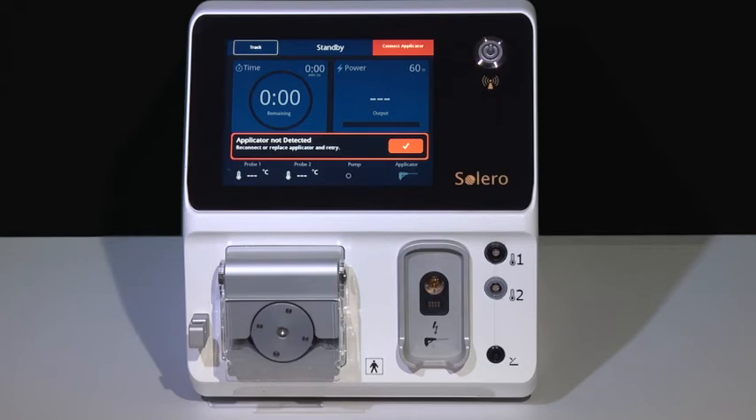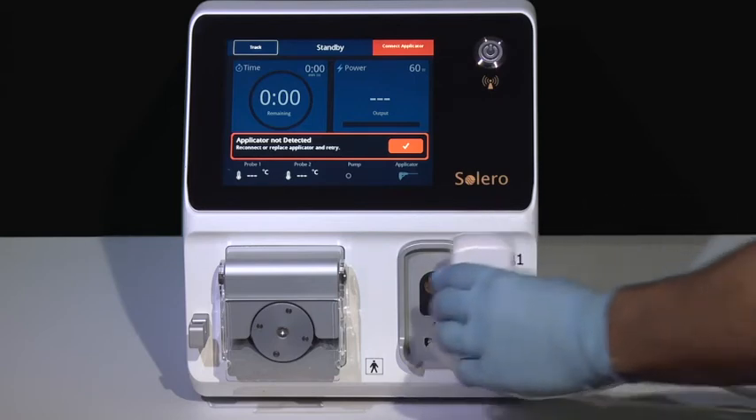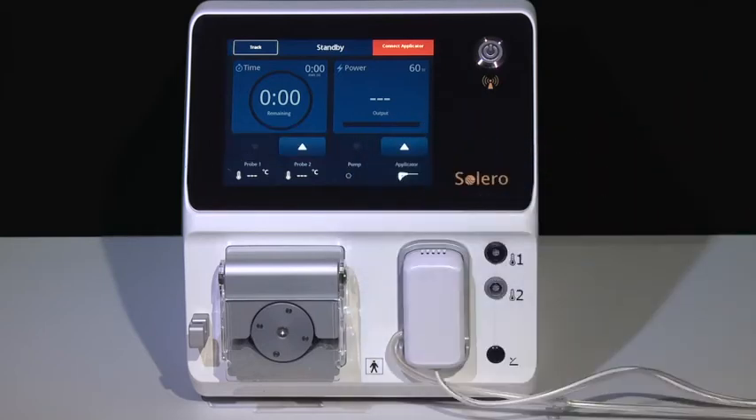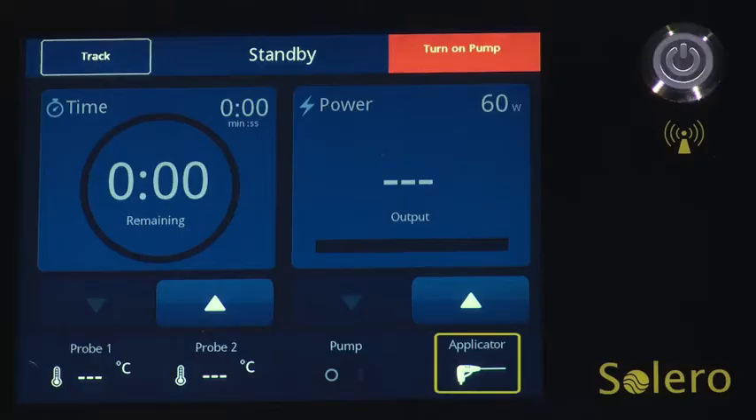Next, attach the Solero applicator cartridge to the face of the generator. Select the checkmark to clear the applicator not detected prompt. Once the applicator is connected, the applicator icon will illuminate solid white.